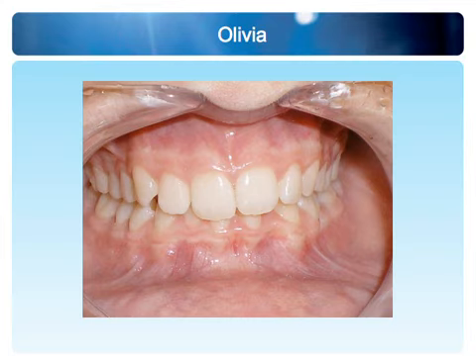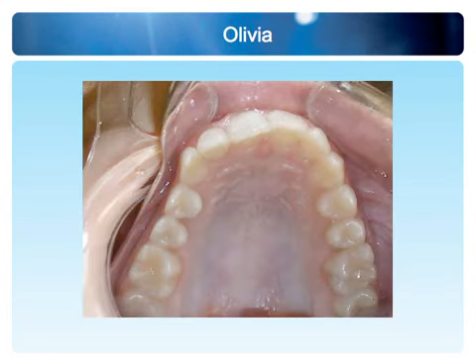Certainly, we recognize that those canines are out of position. There is no canine guidance happening over here. There is a big gap between this canine and that canine. We can count 3 incisors, but we don't see the 4th just yet. So, we are not perfectly level or aligned or derotated. But we have to explore a little further to find out where the problem is.